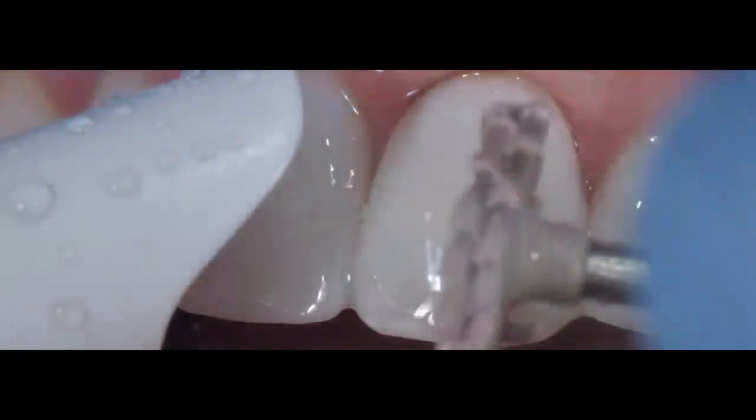And then finally, I'm going to definitely go in with my Shape Guards, which is a two-step polishing system, pink and blue. The pink is just to get you that nice smooth surface. It does remove a little bit of your composite, so just make sure that you don't put a lot of pressure. I would say just stall speed, 250 to 300 RPM underwater with light touches, and then you move forward with the blue. The blue is going to give you that high shine. It's going to make you get that nice and high luster.